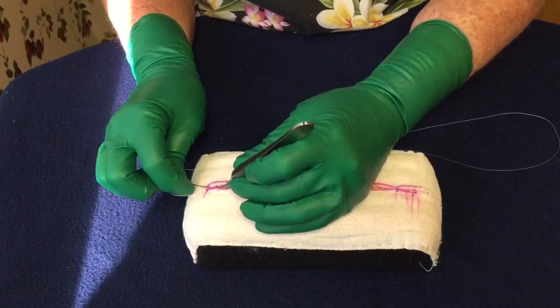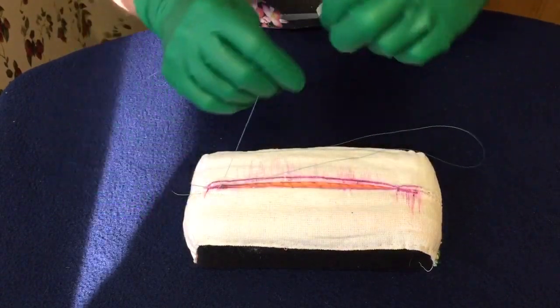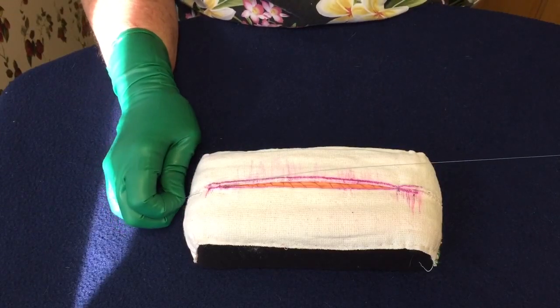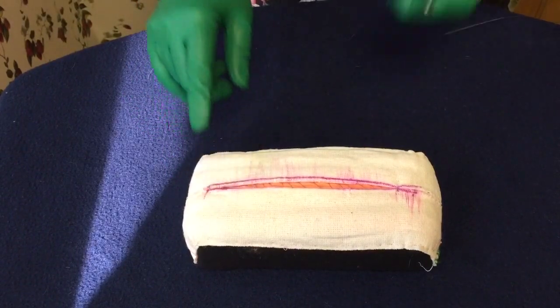Let me take one bite on this side so you can see. If your deep dermal is close together, this works well — it will hold it fine and won't come apart. You just put the Steri-strip on it and Steri-strip it across. That's one of your options when using a Keith needle if you want to take care of the knot.